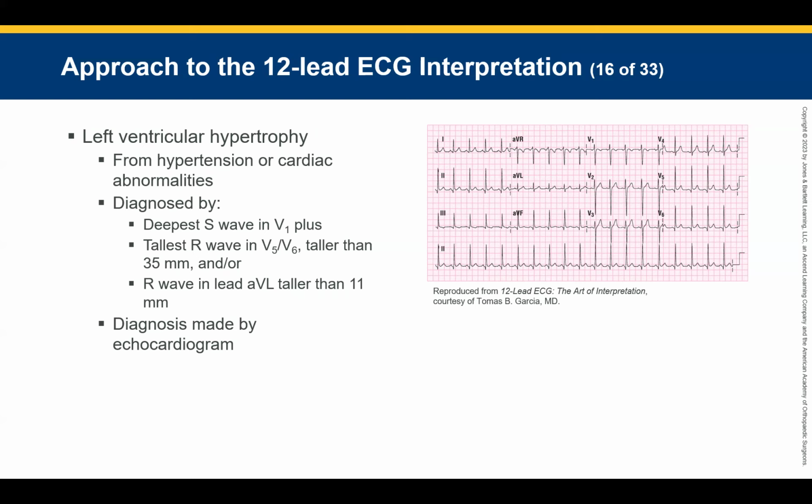We're gonna add a few snippets in here in a minute. So let's say you had elevation in V1, lead 2, V3. Since none of those are contiguous, that won't even happen. We'll get there in a minute. I know what you're saying though. You're saying, what if I have elevation here and here, but they're not contiguous? That doesn't count. Or let's say here and here. That's specifically for a STEMI, correct? We're talking about STEMIs, yeah. So what you're saying is if two are paired together, then that's the only way that it can equal a STEMI. Right, and we haven't quite got this all fleshed out, but yes.